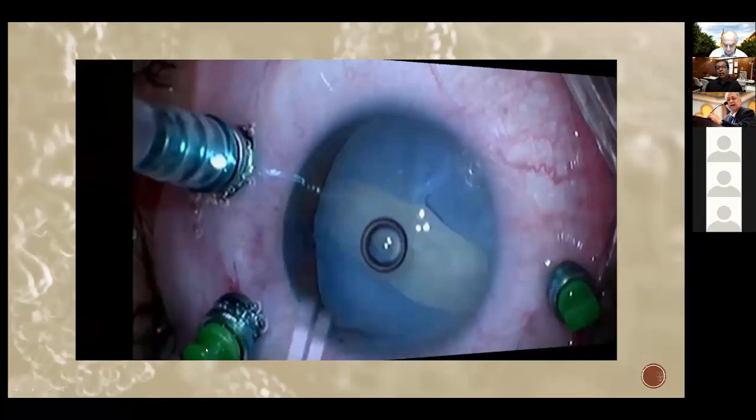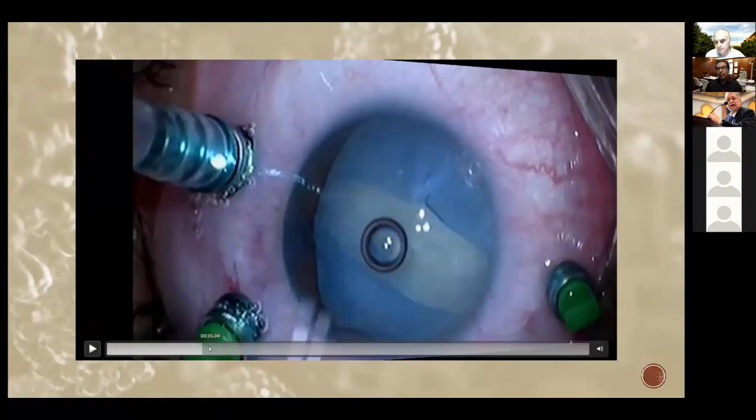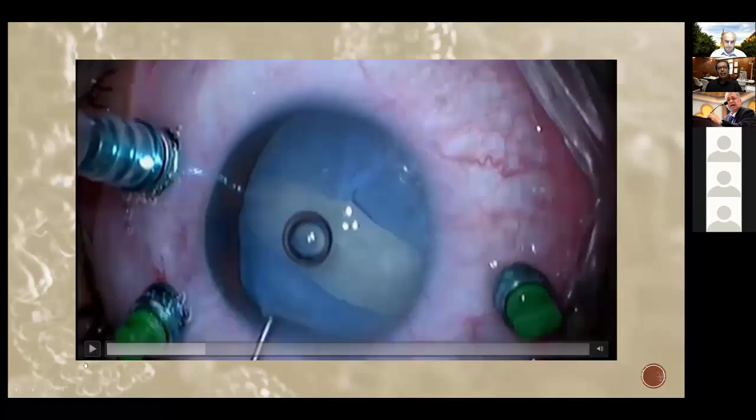At this point, my advice to everybody: do not proceed with phaco. I was already performing vitrectomy and RD, so I had all my settings to go backwards, so I didn't have a problem. I didn't have anything to lose. So I continued my surgery.